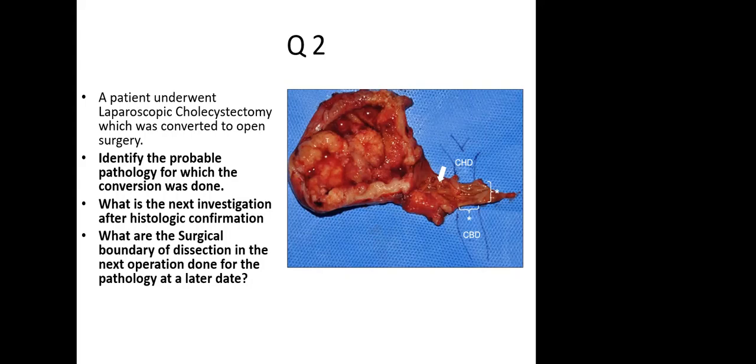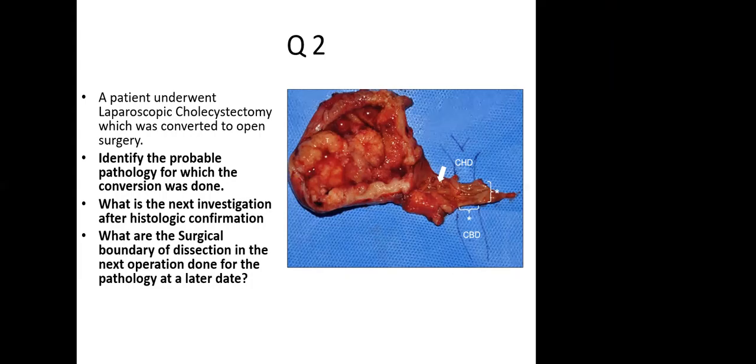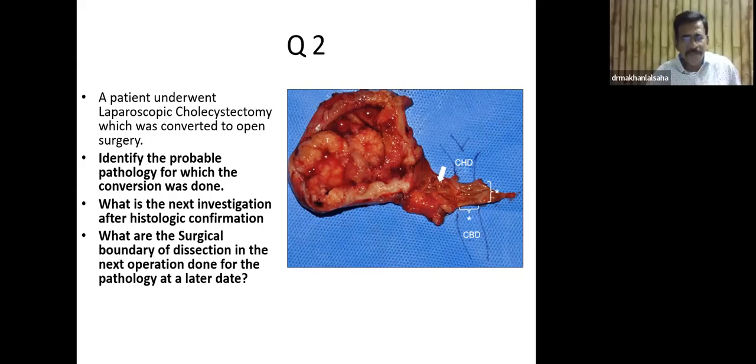Peritoneal and liver nodules are not picked up easily, but you talk of more important things. Evaluation of primary and metastatic disease. So what metastases are easily picked up on CT? Lymph nodes and liver metastasis. Yes, and large omental nodules, pelvic deposits, and peritoneal nodules that are larger you can pick up.